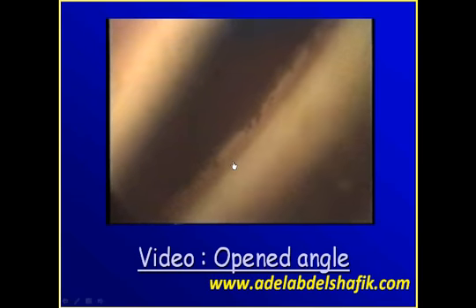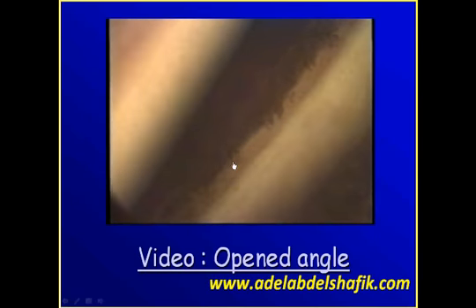So we get the Schwalbe's line here, scleral spur here, and the zone in between is the trabecular meshwork, and this is differently pigmented than this one. This area, the ciliary body, the ciliary recess, and these fine bands are the iris processes. If you see all this, it's an open angle. It's a widely open angle.